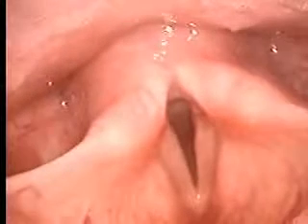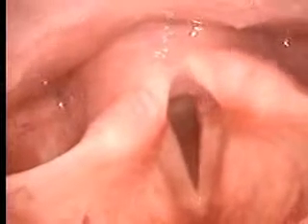The laryngoscope should not be passed through the vocal cords, since contact can elicit laryngospasm. Ask the patient to sniff or to inspire deeply through the nose. This causes maximal abduction of the cords, permitting optimal assessment of this important area. Ask the patient to say "ee" or "ah." In the normal patient, the vocal cords will adduct in the middle and come into contact along the entire length, allowing for a precise assessment.